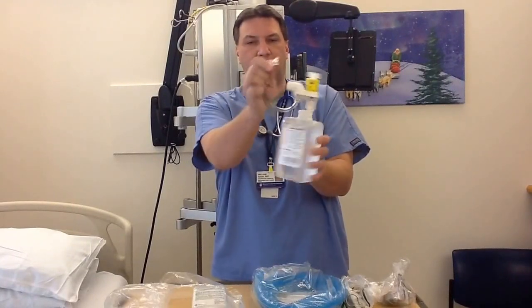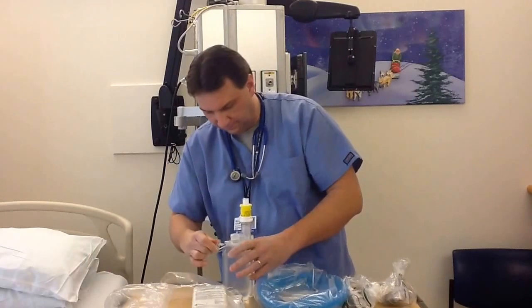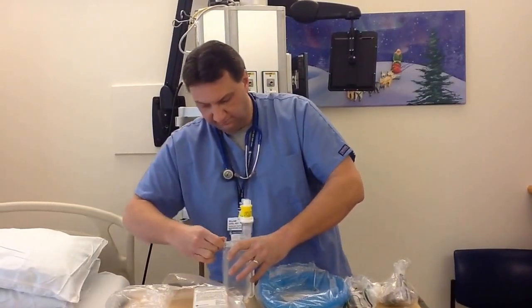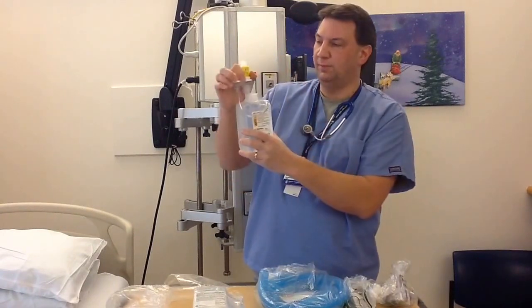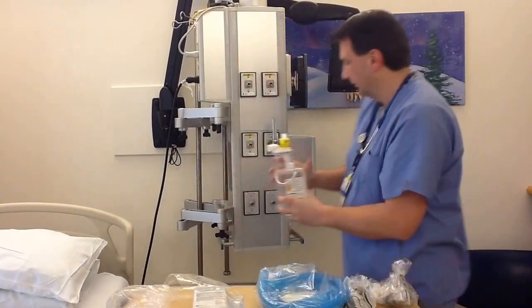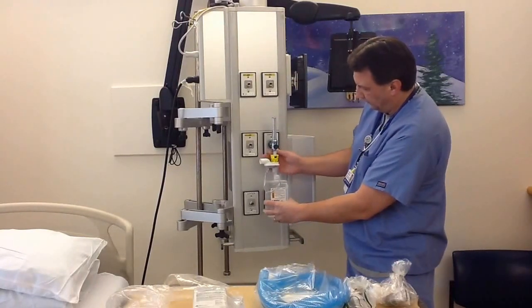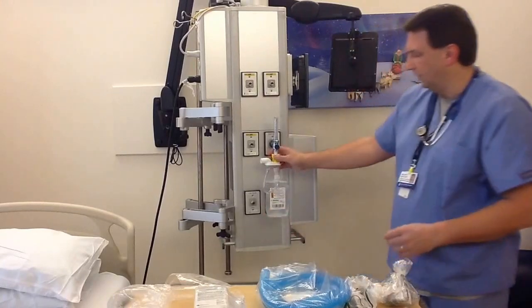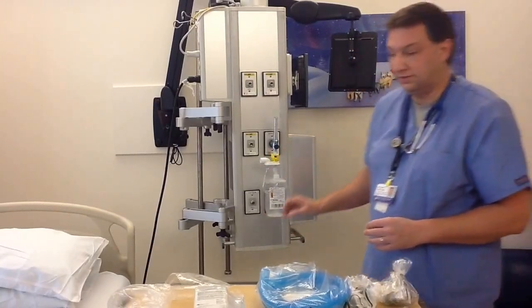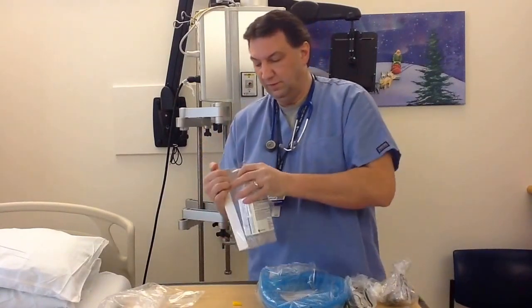Now the top part we're going to insert right into the middle. I'll show you that in a second. And that's how it's going to look when the device is properly connected. And then all you do is just screw the uppermost part onto the flow meter, and there's the setup for this current device. We also have another device, very similar.